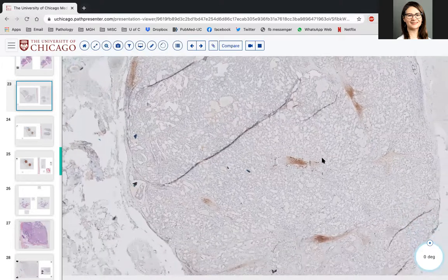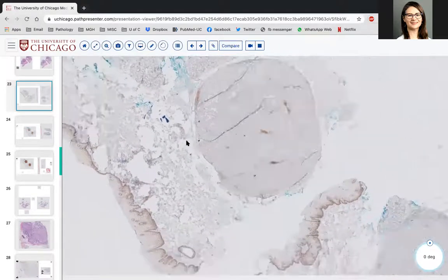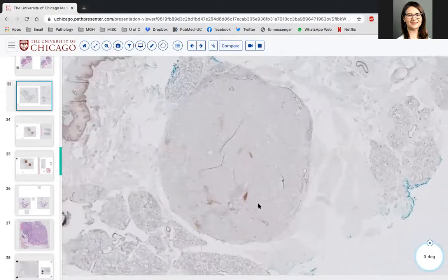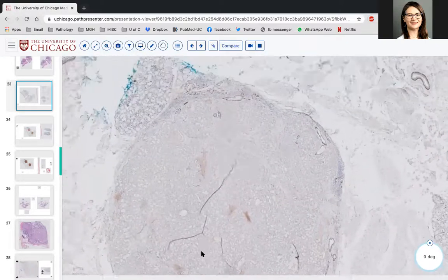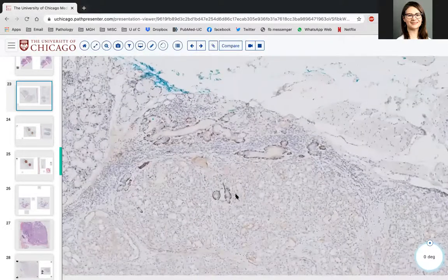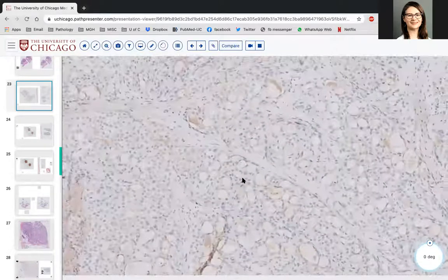You could still definitely think of secretory, or a microcystic variant of acinic cell. You could still think of polymorphous, though I would argue that usually polymorphous isn't quite so secretory or tubular. This is a little more tubular and secretory rich, but those are all definitely possible based on this.